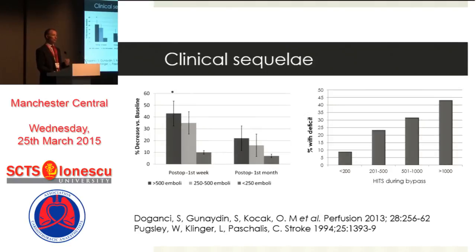And perhaps it should be no surprise that we are unable to detect any difference from those who we think had a high incidence of GME from those who we think were relatively spared. But these are a couple of papers that have either looked at percentage decrease from baseline, or the percentage of patients with a deficit, showing a very neat correlation with exposure to GME.